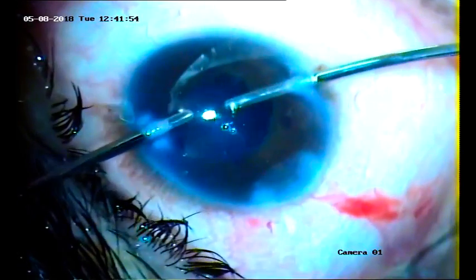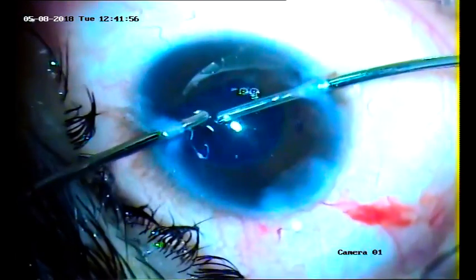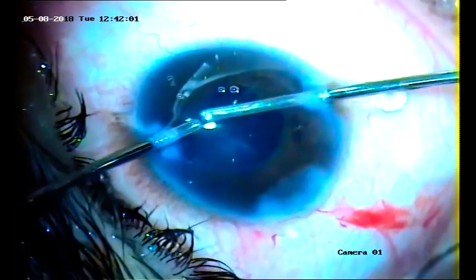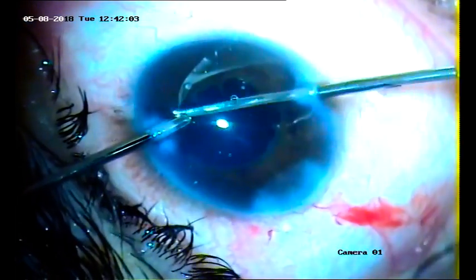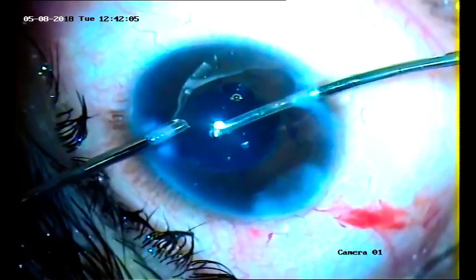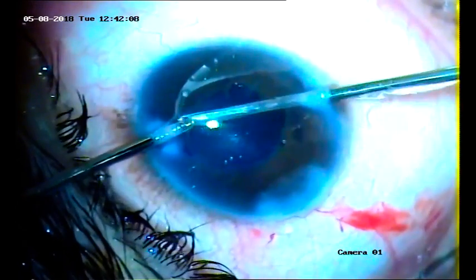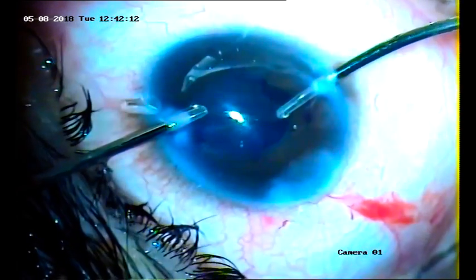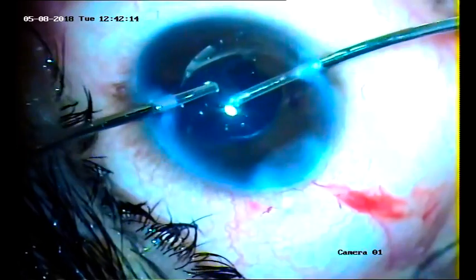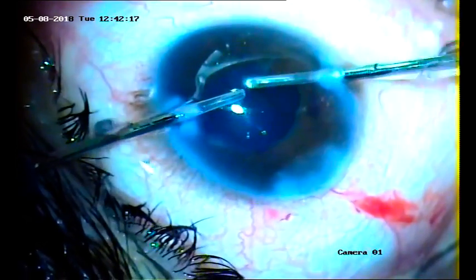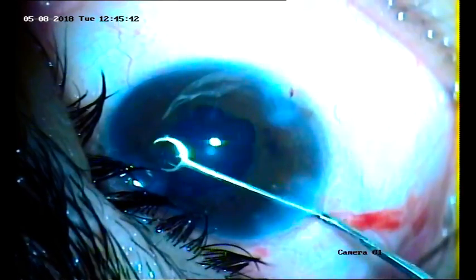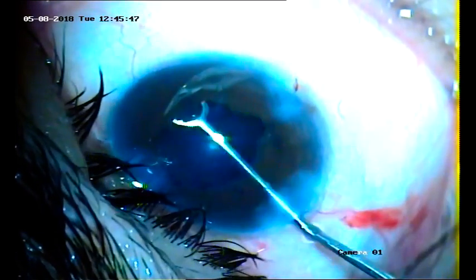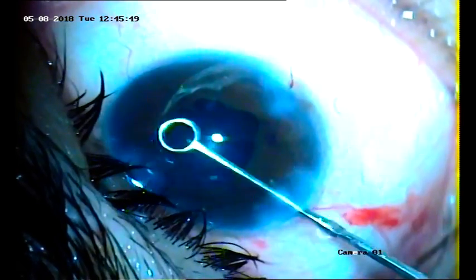This is the cortex removal by the bimanual method — irrigation and aspiration. The capsular bag is polished and the cortex is removed in toto, in order to reduce or avoid postoperative inflammation. The chances of PCO in such cases are very high, so to reduce the chances we have used the capsule polisher.